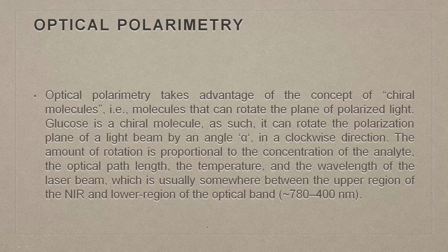So, welcome back to this class. In the last class, we talked about fluorescence resonance energy transfer, or FRET. We talked about the use of fluorescence for glucose detection. Prior to that, we talked about the SPR technique, surface plasmon resonance. Today, in the same line, we will move to another technique, which is called optical polarimetry.